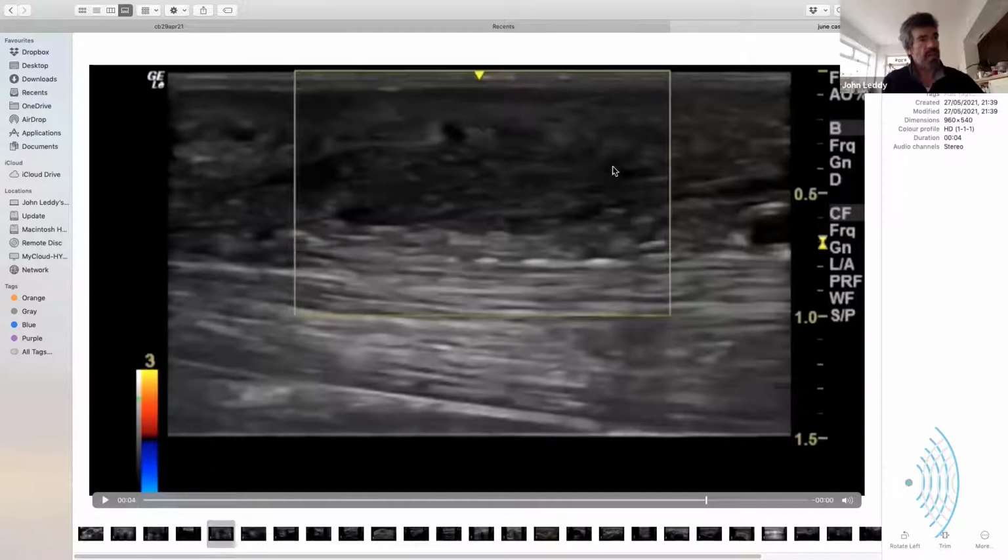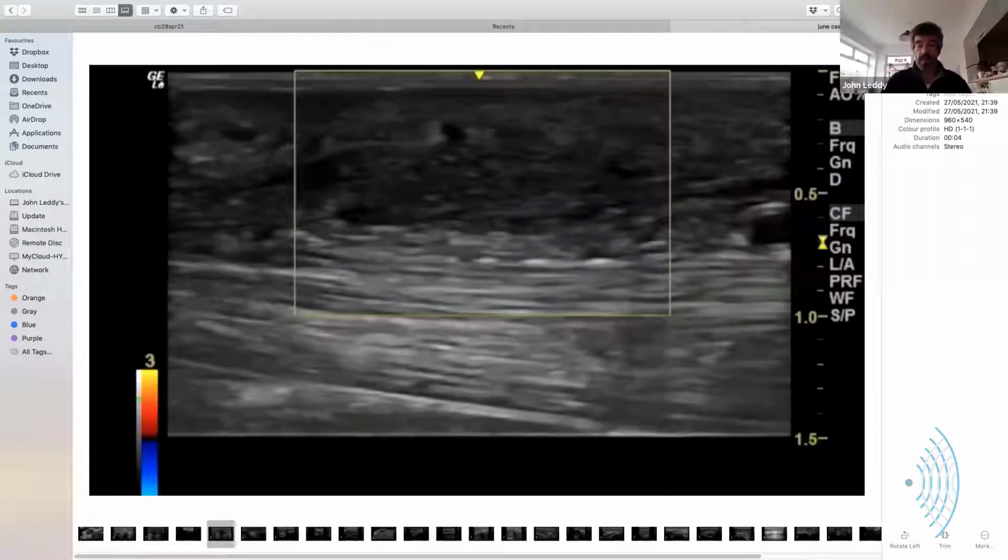So you've got the tendon there, but then you've got this dark mass above it, but it's continuous with the fascia that's running through the palm, and often you see it sort of blending with the underside of the dermis. On a high spec machine, you'll actually see the fibers come off palmaris longus if they've got one, and you'll be able to follow the palmaris longus as it disperses into the palm, and then you'll pick up on one of those threads.